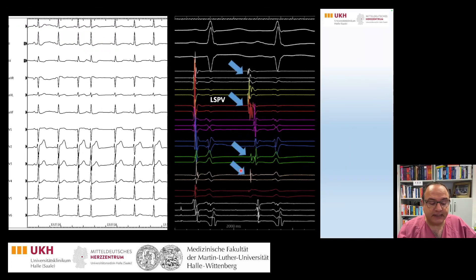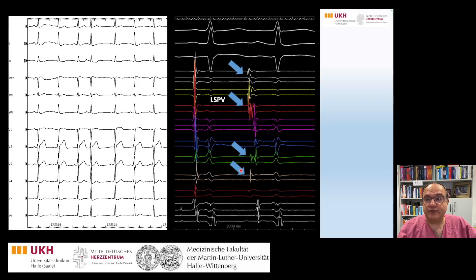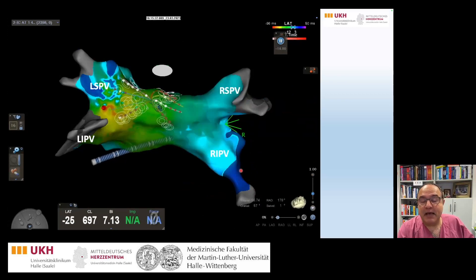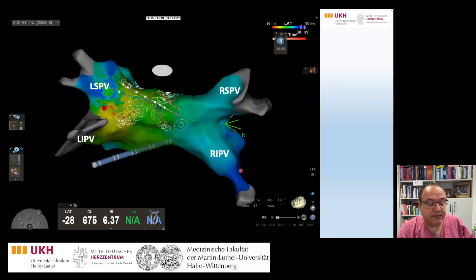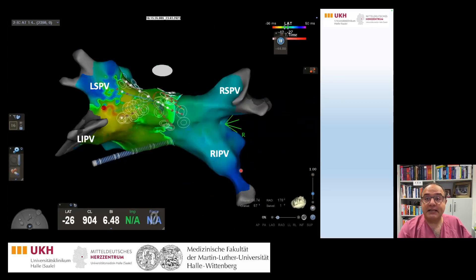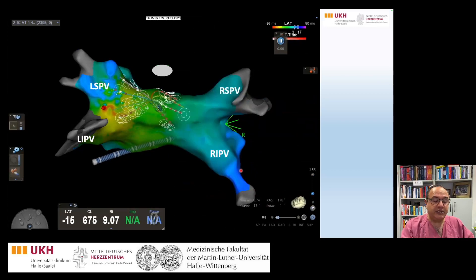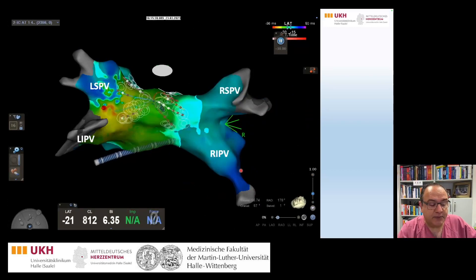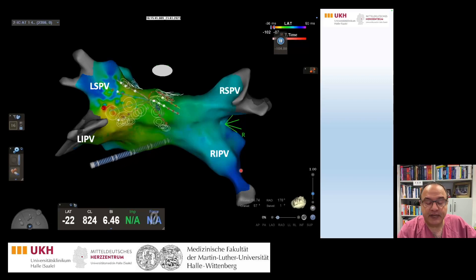Based on multi-electrode mapping with automatic CS pattern matching, we were able to automatically map these premature atrial contractions. Based on ECG, we thought it might be very close to the left superior pulmonary vein or left atrial appendage.